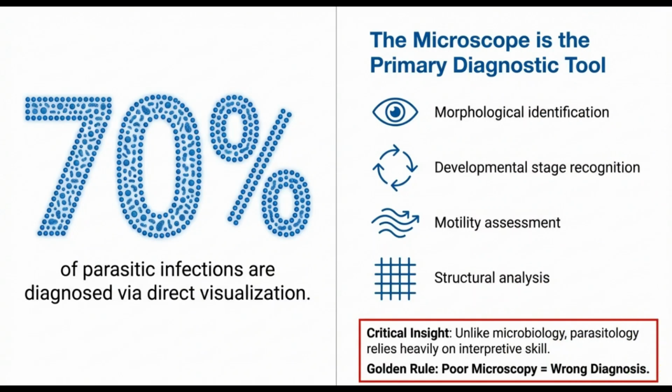Okay, let's start with a number that might surprise you. A full 70% of parasitic infections are diagnosed simply by looking, through direct visualization. It's not about complex chemistry, it's about what you can see and interpret with your own eyes. And that requires a very specific skill set.